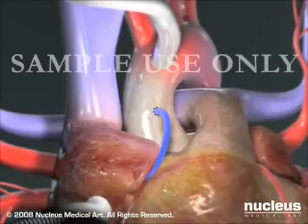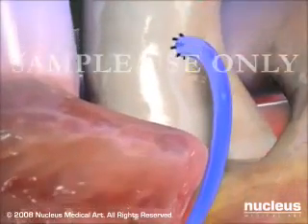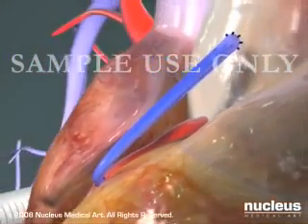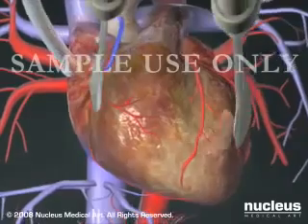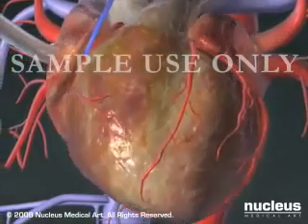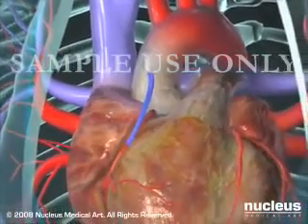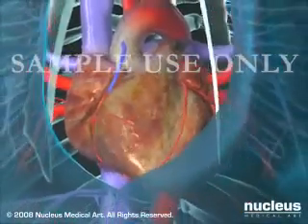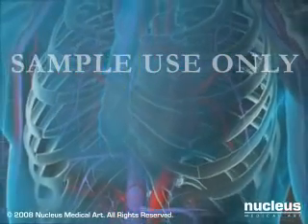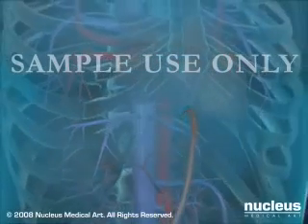For the saphenous vein graft, your surgeon will suture one end to the aorta and the other end to the narrowed artery just beyond the blockage. With the graft securely in place, your surgeon will use electrical signals to restore the heartbeat and attach a temporary pacemaker to the heart. Once your heart is again beating normally, the heart-lung machine will be disconnected. Your surgeon will wire the breastbone back together and suture the skin incision closed. A temporary drainage tube will be placed through the skin beneath the incision.